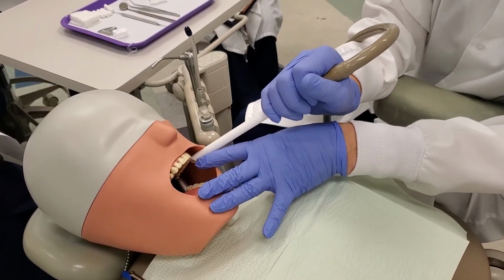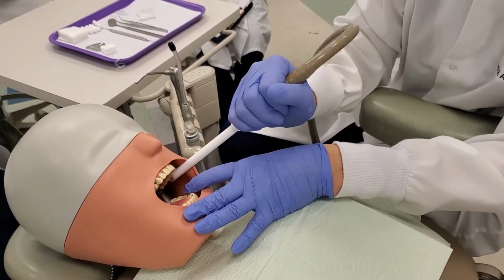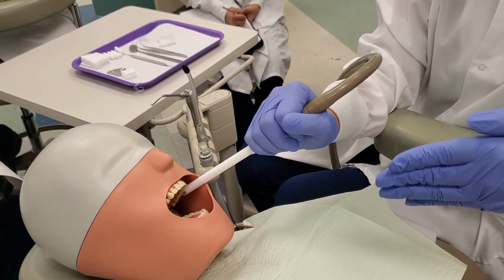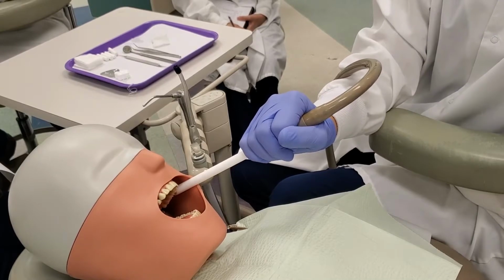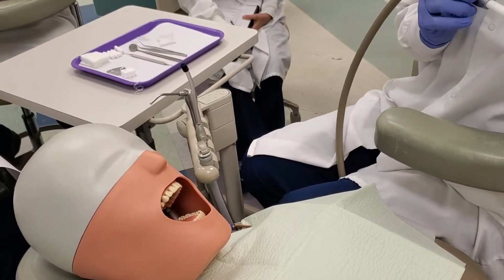So if we're working on tooth number 14, I'm going to have this back here by 15. The bevel edge is going to be facing back toward the patient's mouth. It's going to be parallel to that tooth, and you're not touching any tissue. Don't be resting this bevel edge on the tissue because you'll cut the tissue. It's easy. Okay, so let's go back to the beginning.